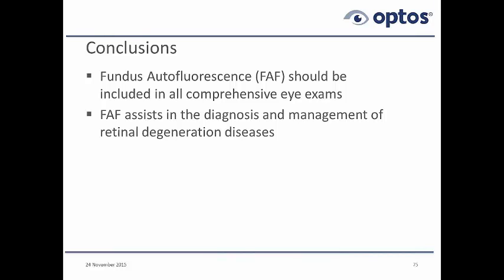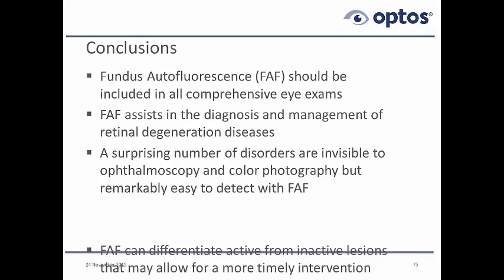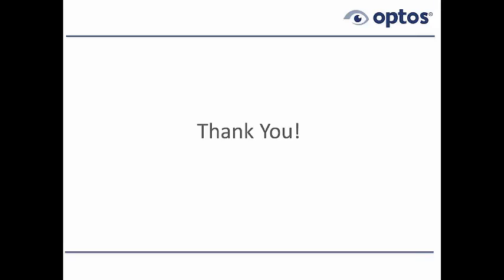Autofluorescence assists in the diagnosis and management of a whole series of retinal diseases. And as I've tried to demonstrate, there's a surprising number of disorders that are invisible to ophthalmoscopy and to standard color photography, even ultra-wide field color photography, but remarkably easy to detect with autofluorescence. And the autofluorescence can differentiate active from inactive lesions, and that may allow for more timely intervention if there is treatment available. And I thank you very much for this very late hour.